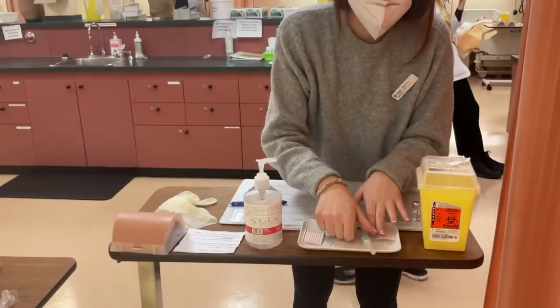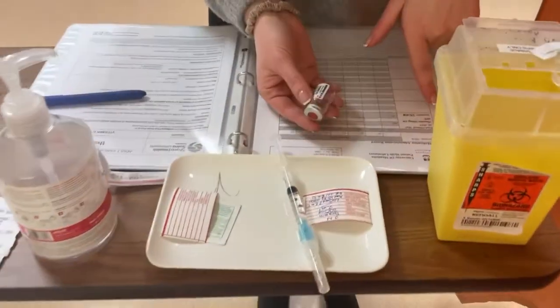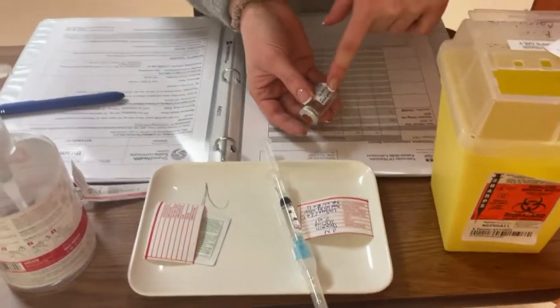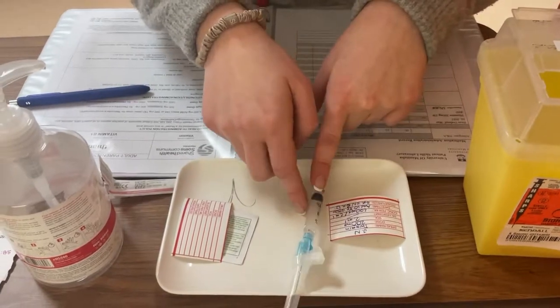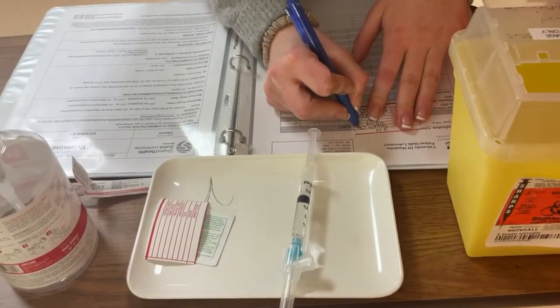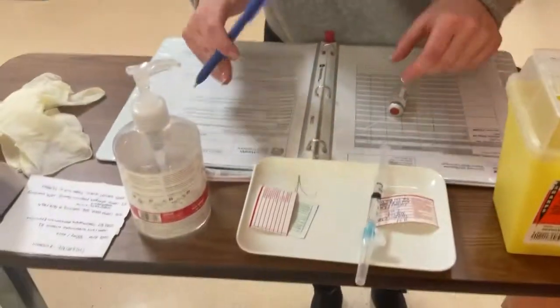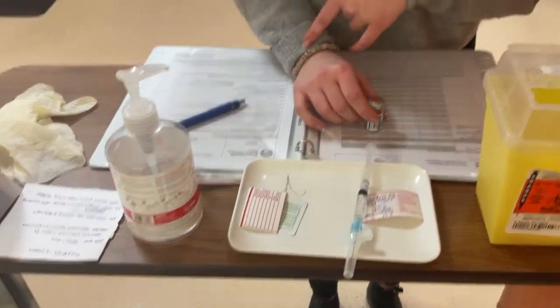So I will perform another check. I have thiamine, right medication. I have 200 milligrams per 2 milliliters, and 200 milligrams per 2 milliliters drawn up, which is perfect. I have it given intramuscularly. I will make a note that it's given intramuscularly. And I have it given twice a day. I will be giving the morning dose.